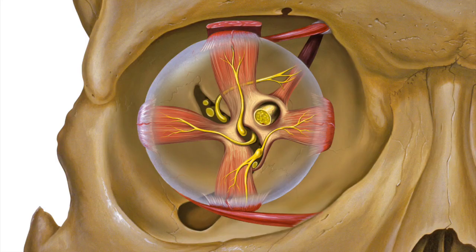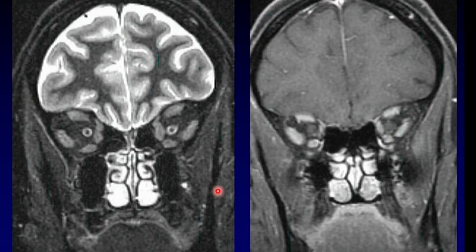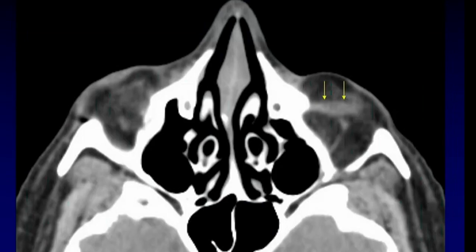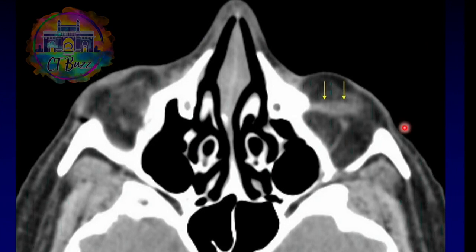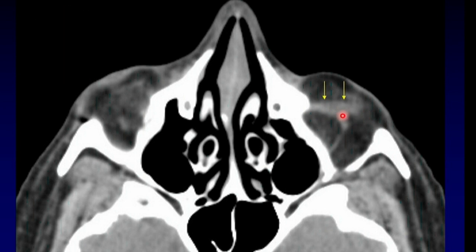Remember that there are only five extraocular muscles that we can see on a coronal image: four rectus muscles and one oblique muscle, which is the superior oblique muscle. If you want to find the sixth extraocular muscle, that's the inferior oblique muscle. It does not go back to the annulus of Zinn — it is only anterior — and you can see it on an axial high-resolution image as it runs from the bottom of the globe medially to insert upon the orbital rim.